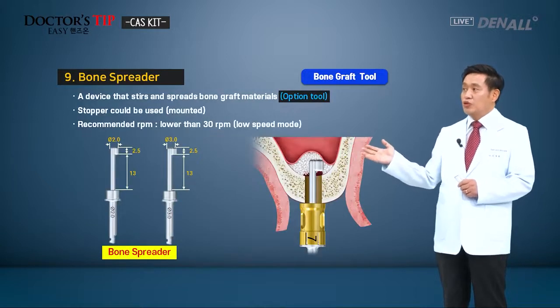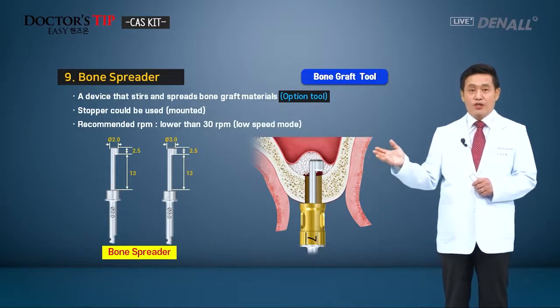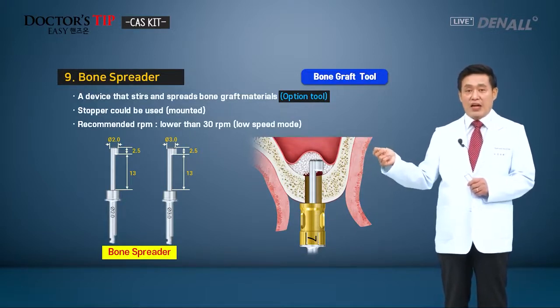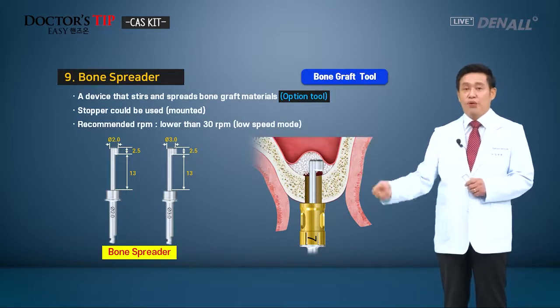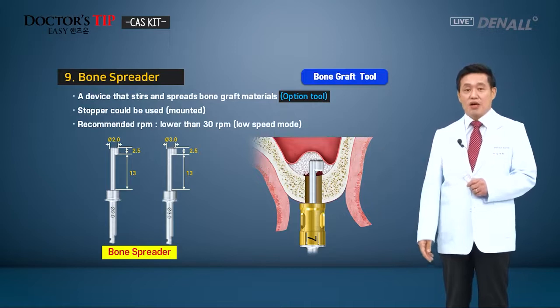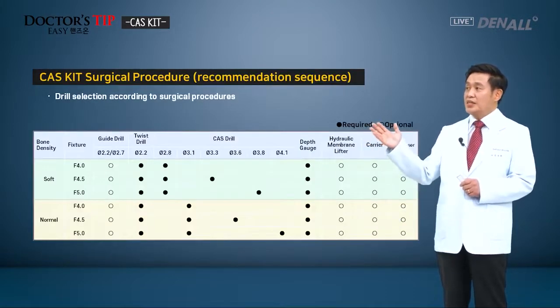Next, bone spreader. This is an optional tool. When you do the implant placement, if the graft material is blocked and stops being pushed in, then the bone spreader can be used to spread the blocked bone material.